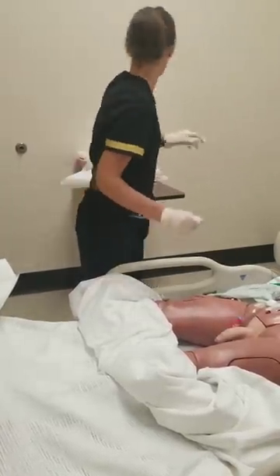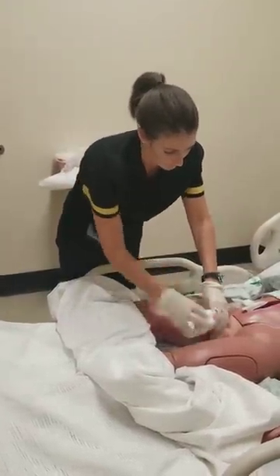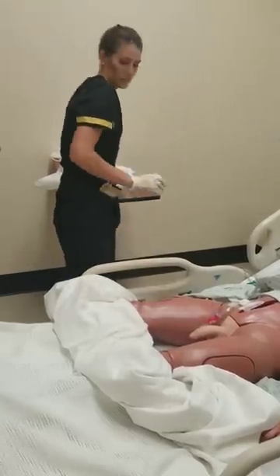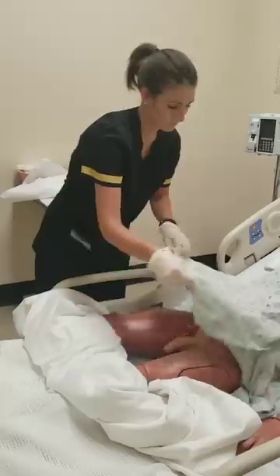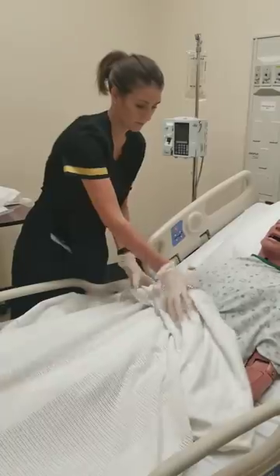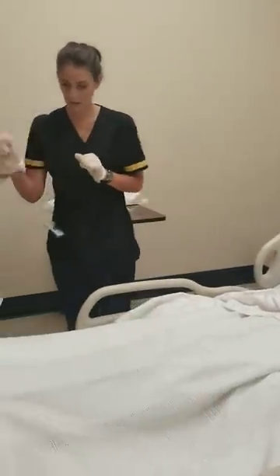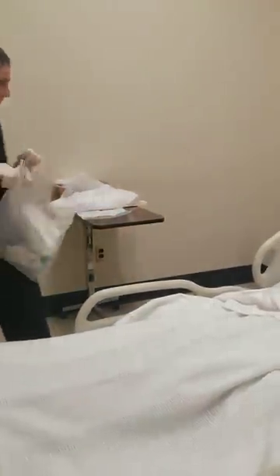And we're going to wipe the betadine off of you. Okay. Let me move you back up. Do you feel any discomfort, or do you feel okay? All right. Well, I am going to leave now and I'll be back to check on you in a few hours.